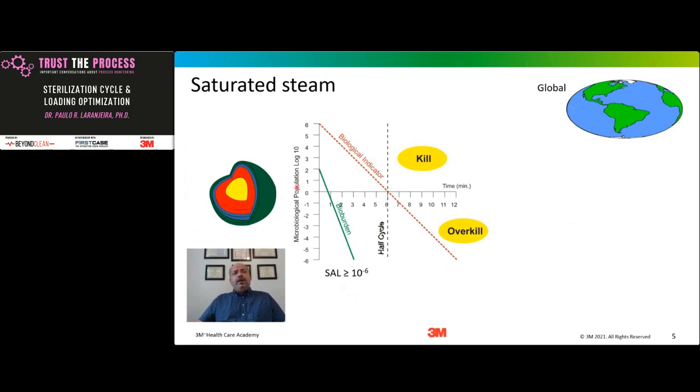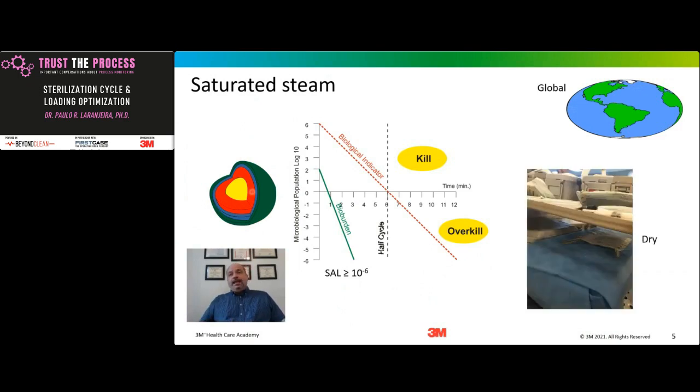In sterilization, the objective is to inactivate the spores that we have inside or on our devices. And at the end of the sterilization, after the whole process, when I open and remove the cart, my load cannot have water. You cannot have water. What I'm showing here has to be dry. So today we are going to see how we can achieve these two goals by optimizing what we have today.